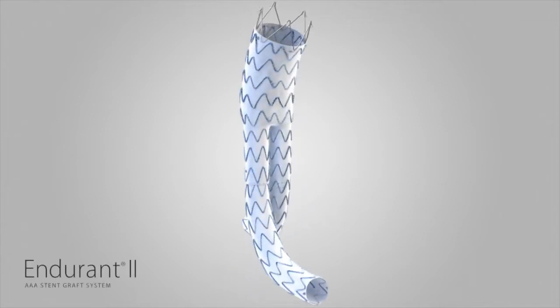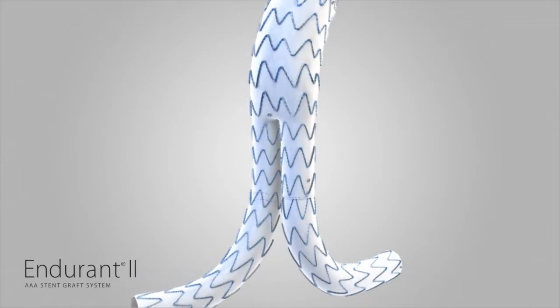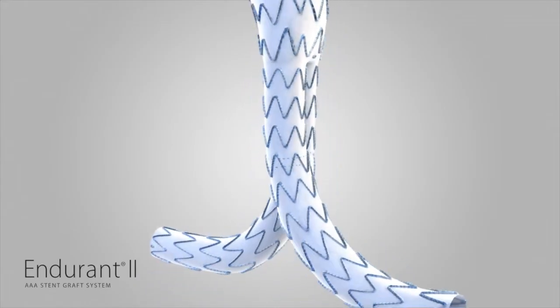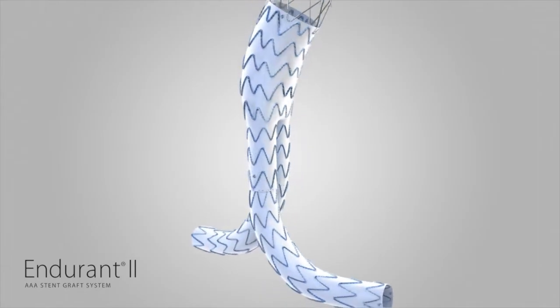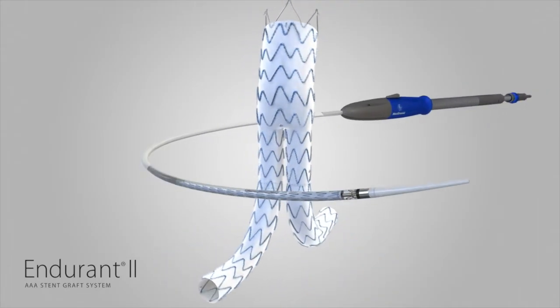The Endurant II StentGraft system is designed to treat patients with abdominal aortic aneurysms using the endovascular approach. When placed within the aneurysm, the Endurant II StentGraft provides a permanent alternative conduit for blood flow within the patient's vasculature, thereby providing a minimally invasive alternative treatment choice in lieu of open surgery.